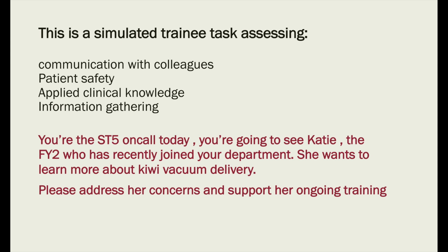Also, if we anticipate some bleeding disorders in the baby, like if the patient has a family history of bleeding tendencies and we anticipate the baby will have this problem, then if we apply a cup we also put him at risk of bleeding. Another contraindication is if the baby has a non-vertex presentation. That means if the baby is coming with a face presentation, or if it is breech, we can't apply the cup.